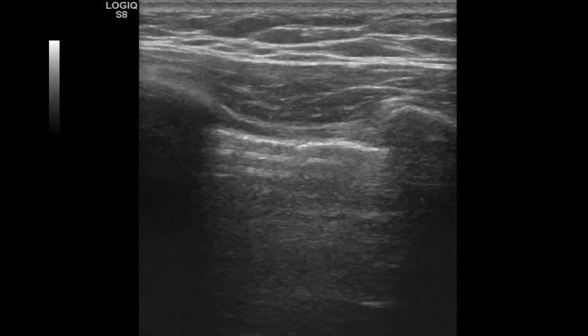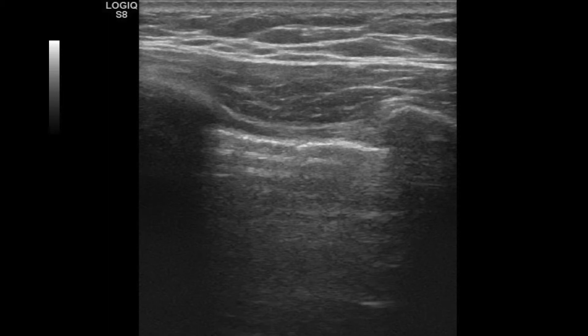Looking at an actual ultrasound image, we see the ribs bookending either side — hyperechoic cortex with dark shadow columns deep to them. Immediately deep to those ribs is a hyperechoic, thin echogenic line representing the pleural line. It's important to identify the ribs first because it's easy to confuse the pleural line with a fascial line in the superficial subcutaneous layer. You must look for the ribs as the landmark to guide you to the true pleural line.